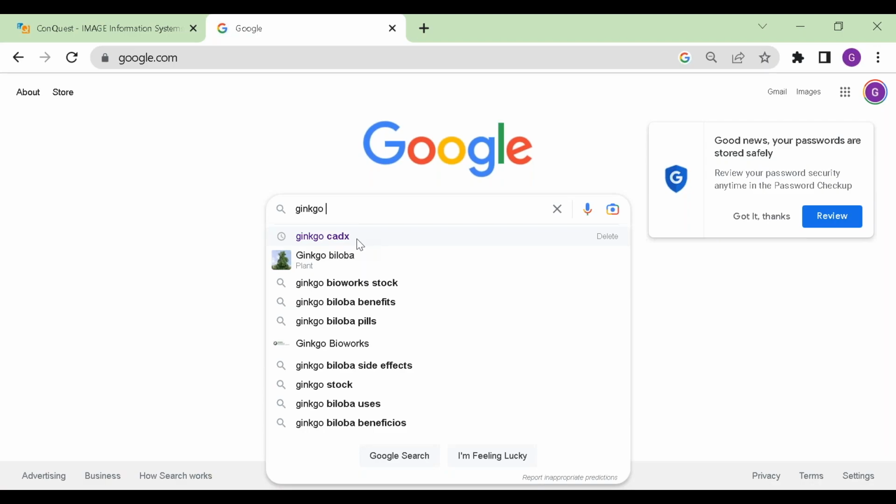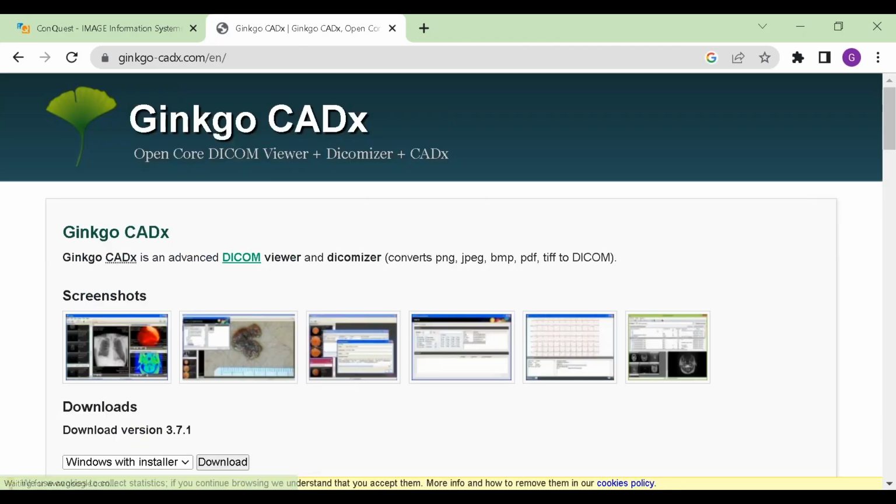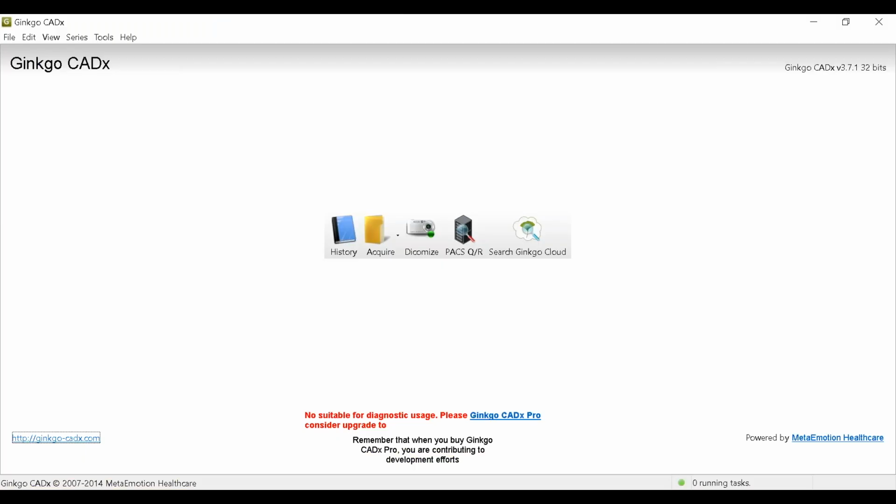It's important for me to point out what CAD is: computer-aided detection. Remember when I talked about that AI software reading bit by bit? That's a CAD system. So you want a CADX. This is free. It was born in Spain, so if you see some Spanish, hey, that's why. Notice it's got a downloader here. You can just go ahead and hit the download, and it should download there. I've gone ahead and done all of this already and ran the installer, and there you go. By the miracle of television, we're already installed. That was fast. I wish they all installed that smoothly.